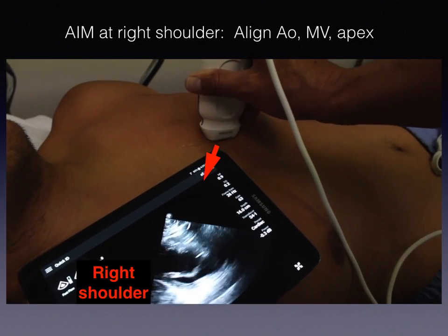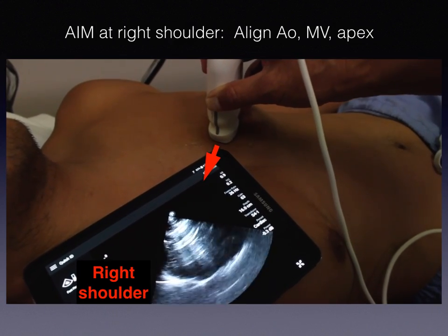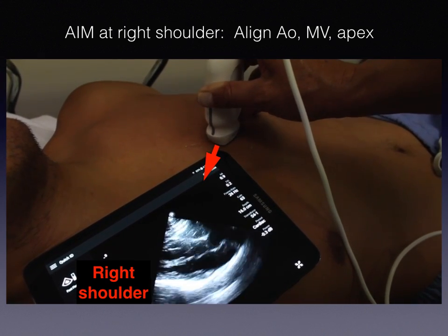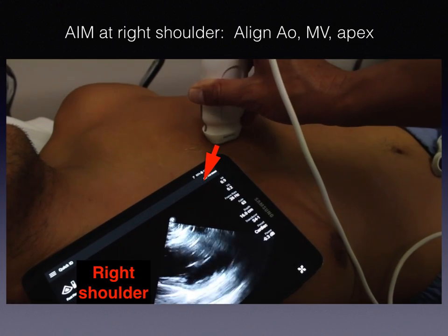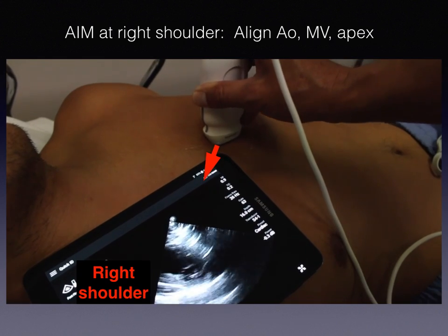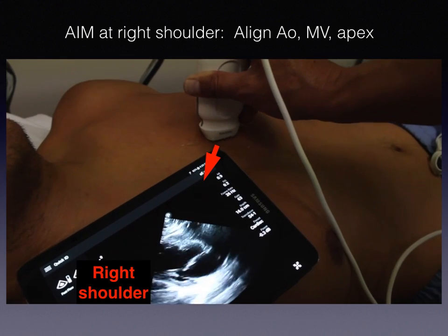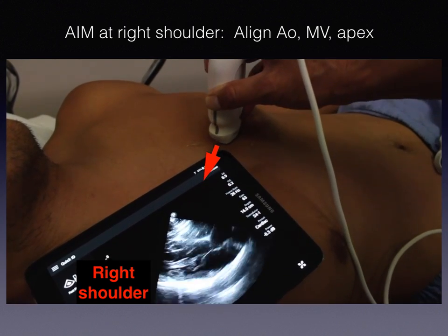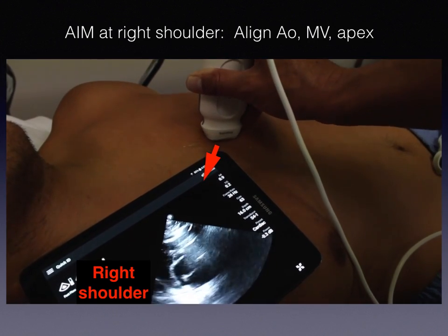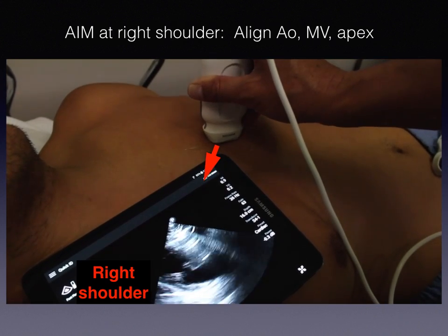Error number 2 is a rotational error. It's easy to be off axis. And what you're seeing in this video is the rotation from the right shoulder where it should be and off axis towards the neck. 9 out of 10 times you want the plane of the beam aimed toward the right shoulder, which will cut the LV in long axis. The first thing you want to do is to locate the aortic and mitral valves and then rotate to get the LV in long axis.